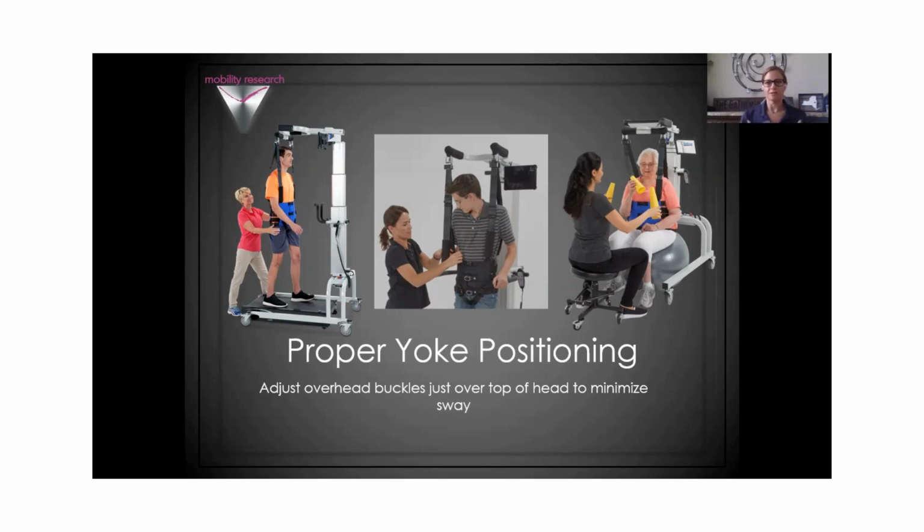We also create stability and postural control through the overhead straps and how we tighten them. So we can correct for posture. If they lean to the side, we can correct for that and give them some good stability in their trunk. One of the biggest benefits and what separates the LiteGait from most other devices is that I can provide support on one side completely independent from the other side.